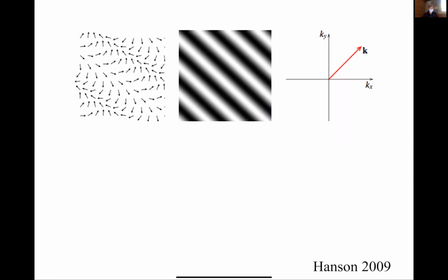So just to recap, a lot of times we'll draw things like this, spatial variations, and this corresponds to a place in K-space like that, simply because we can use our little mnemonic and draw perpendiculars to that. But we're also going to want to start thinking about things in terms of spin phase, because what underlies this is that we don't have this in MR. What we have is this.